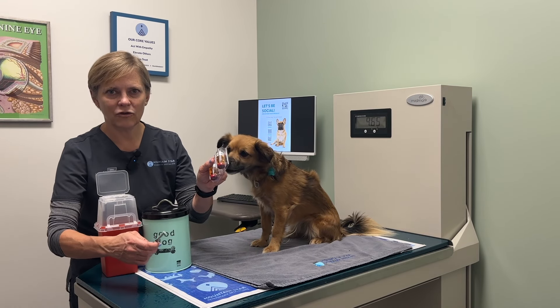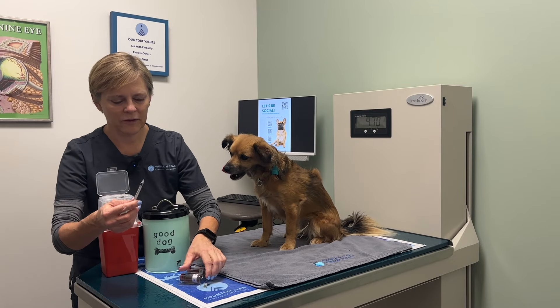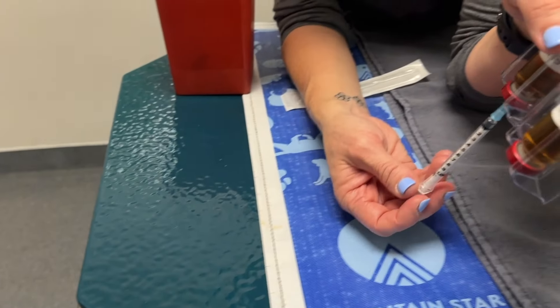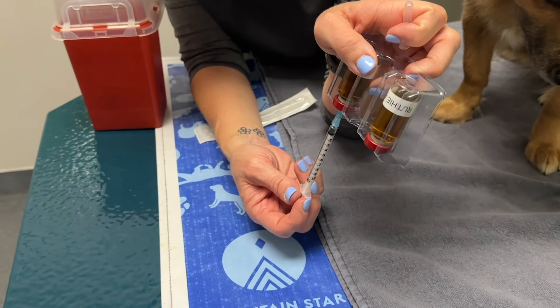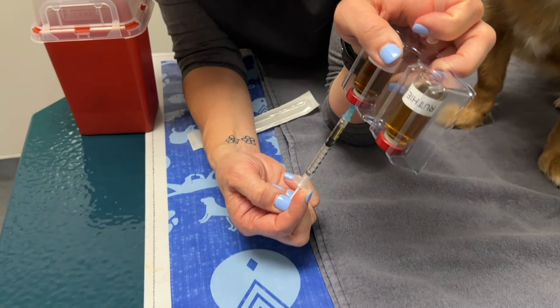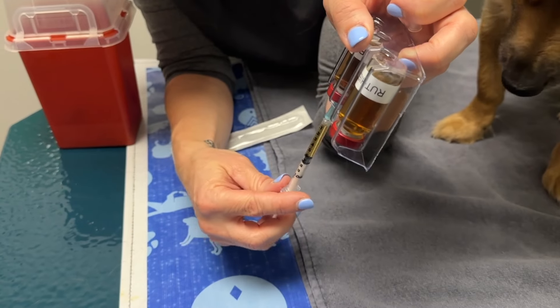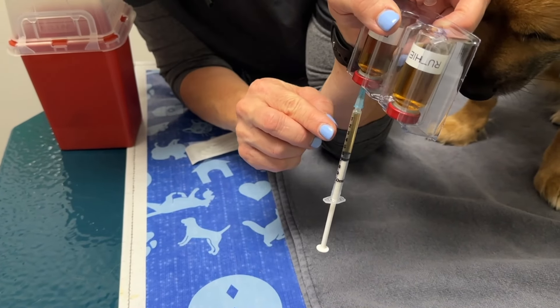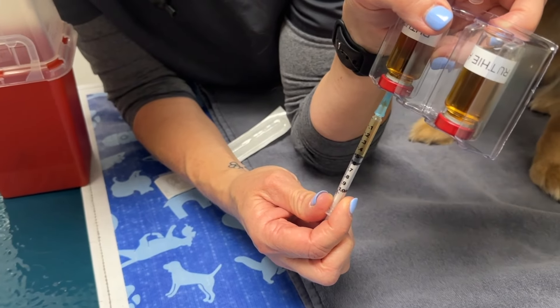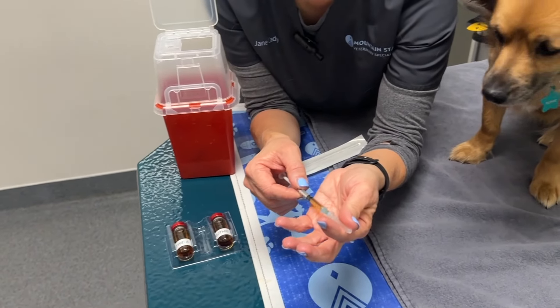First thing to do is to draw up the medication: uncap the syringe, put it in the bottle, turn the bottle upside down, and draw it up past the line that you need. Give a little tap and inject it back up. She needs 0.5, so I'm going to go back up to 0.5, pull it out, and carefully recap it.